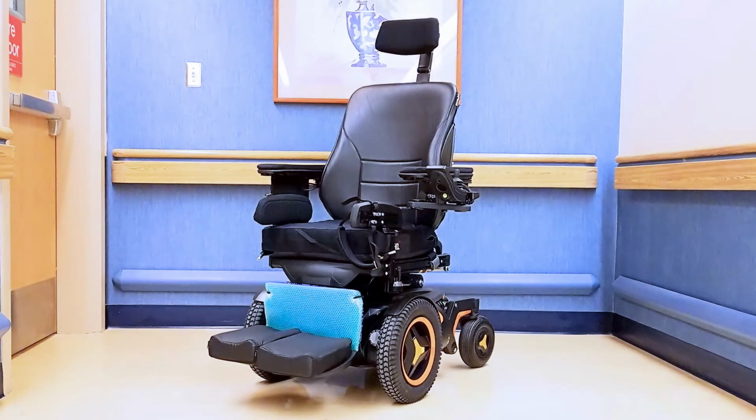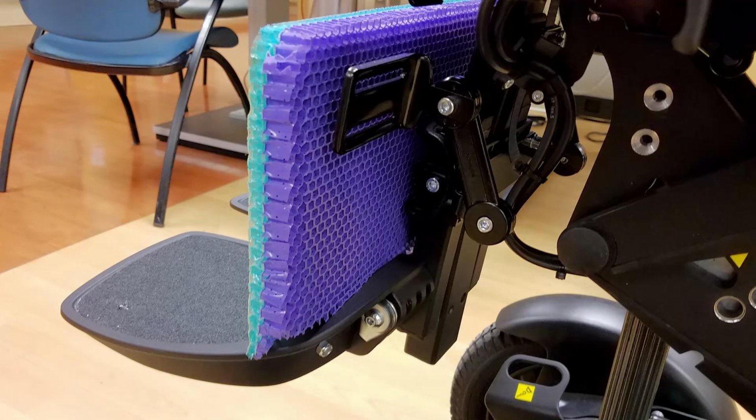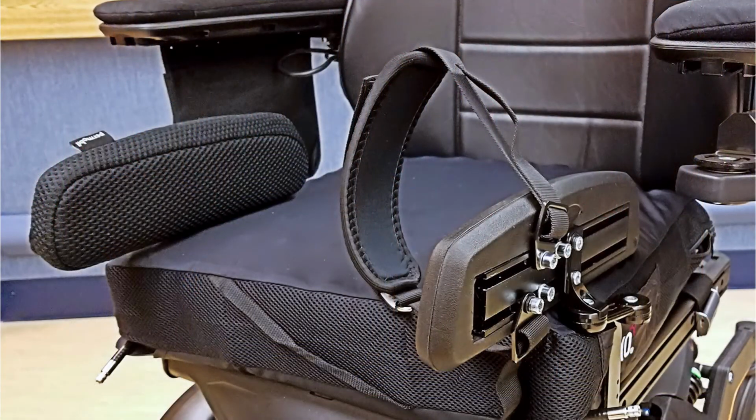Do you have closer up on Steve? Vector visualization. So where is all that force from his flexor hamstrings mostly going? Into that honeycomb. Yeah, and it would continue to bend back the more that you could shorten the seat depth, and it would still keep bending back. So at some point you had to provide a reasonable amount of force to mitigate that pressure, knowing that there's still going to be some pressure there. And then kind of manage the adductor and the knees from contacting each other.